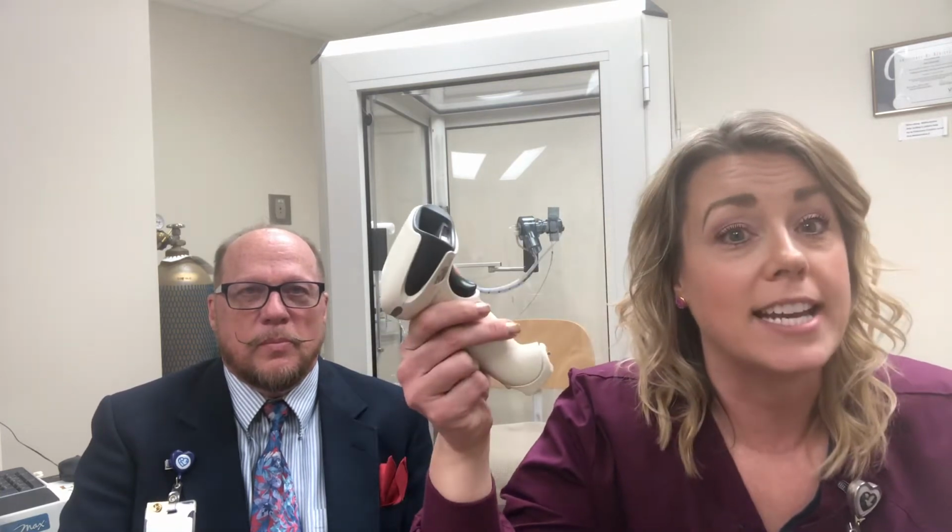So first, just like anything, you'd want to go to your medication administration. You'd want to use your handy dandy little scanner, just like you do for your meds. And you'd pull it out of the Omnicell, and it's a foil packet, and you would scan the back of the foil packet. For practicing, we just have some saline that we're going to use to show you, but the main thing is, you still want to scan the medication.